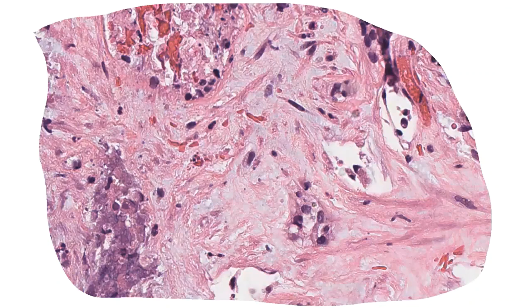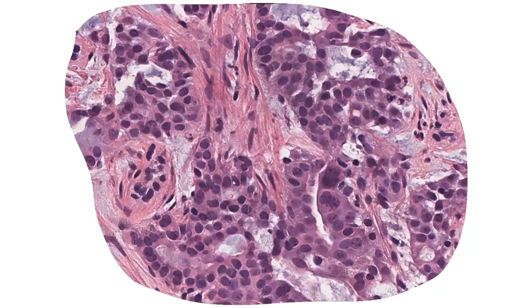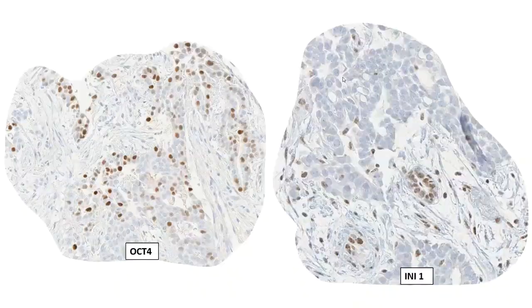You are also seeing the presence of necrosis within the tumor. And over here, you have these cribriform tubules forming a maze work of atypical cells, which have obviously got high-grade nuclear features. And look at the presence of the slightly mucinous matrix in the background of the tubules.